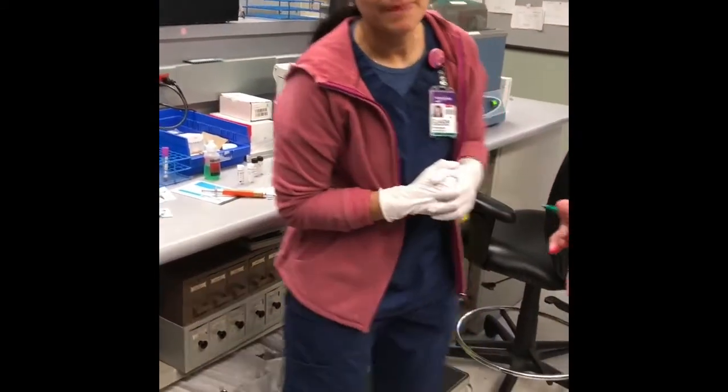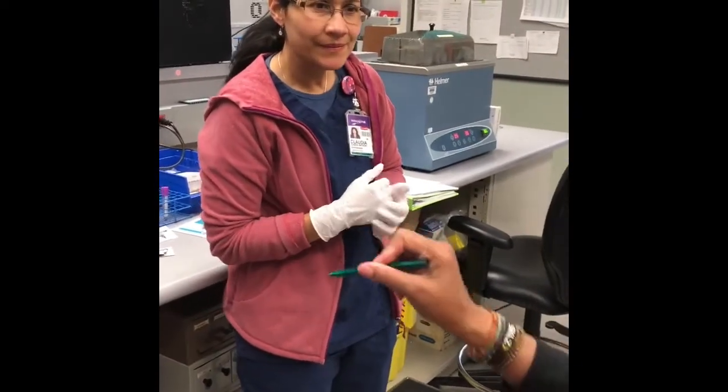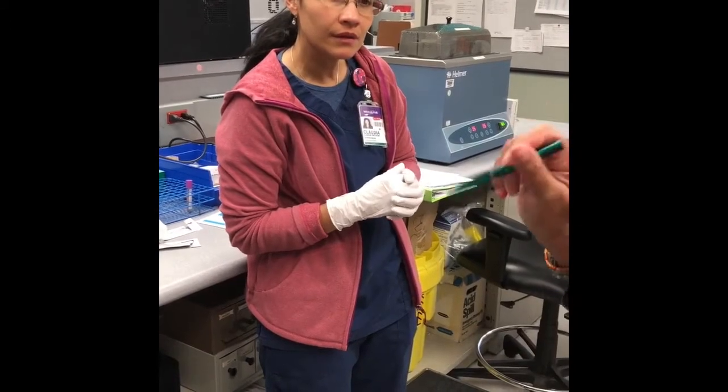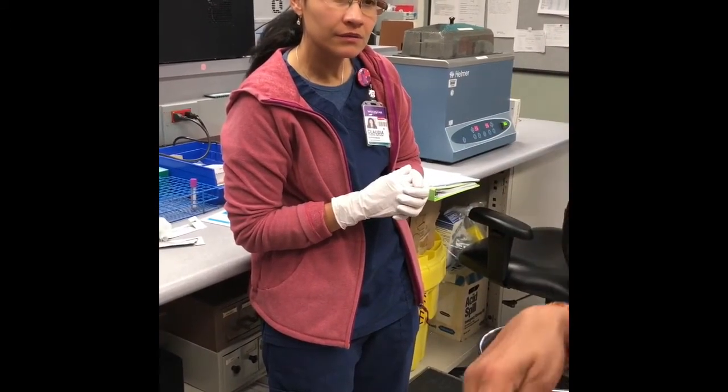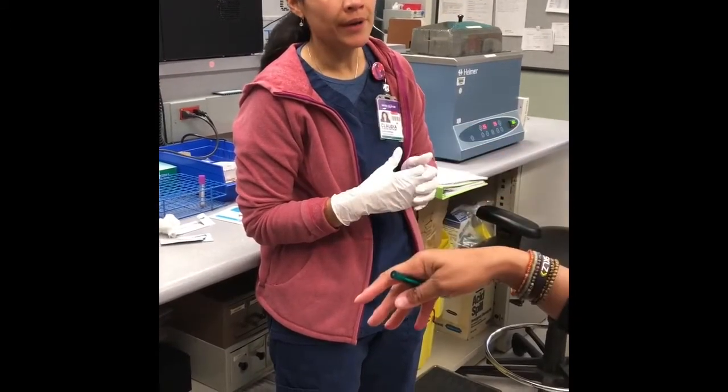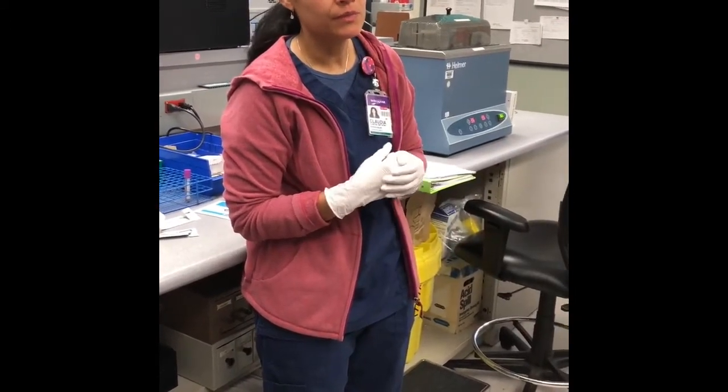I'm sorry. I hate to ask this again, Claudia, but before we do the differential, if we see less than 5, we're just going to hide. Well, I'm talking about in the computer now. It will hide right away in the system.